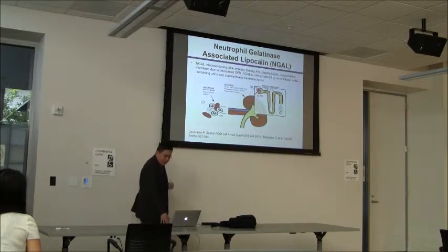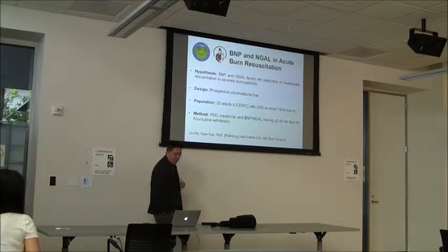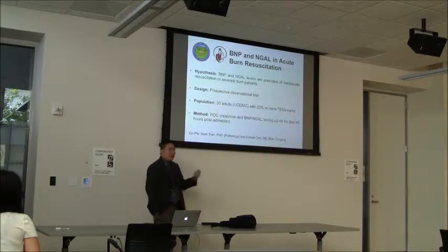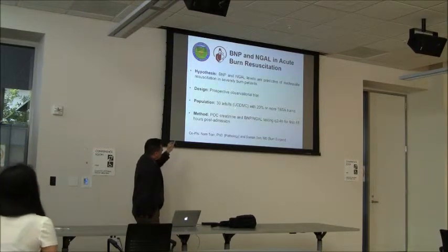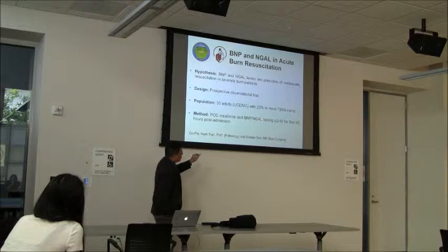Okay, is that fair? So we hypothesize here that BNP and NGAL working together are predictive of inadequate resuscitation in severely burned patients. We conducted a prospective observational trial, meaning that we're collecting patients as they come in, samples as they come in, but we're not giving results out for doctors to treat. We looked at 30 adult patients with 20% or more burns at UC Davis. We measured creatinine at the point of care. We measured BNP and NGAL at the point of care.